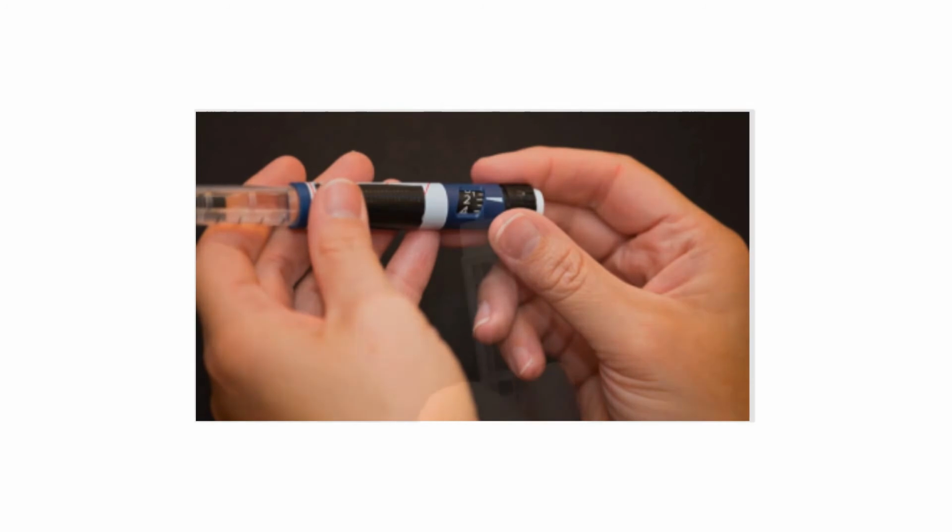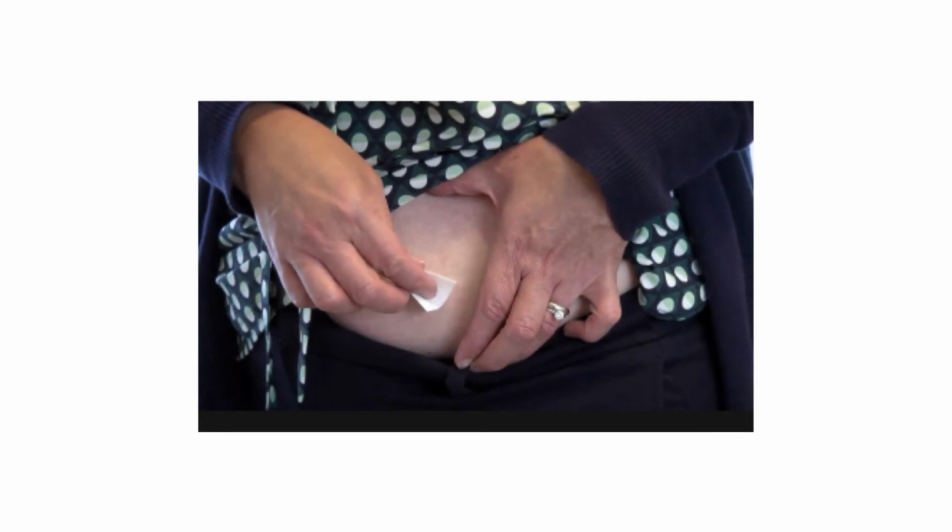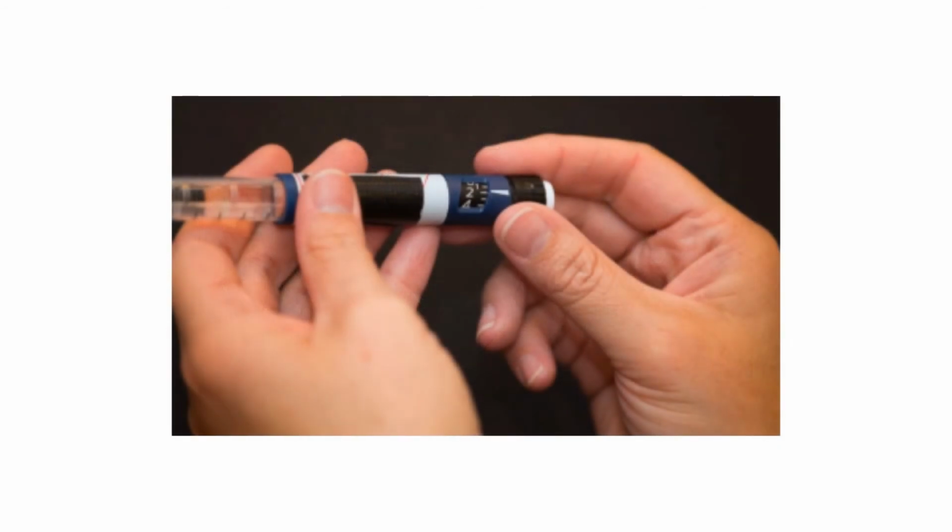Prime the pen by setting the pen to 2 units. With the pen pointing upwards, press the button at the end of the pen. You should see insulin coming out of the needle of the pen. This means the pen is primed and ready for injection. Clean the injection site with an alcohol swab and allow to dry.